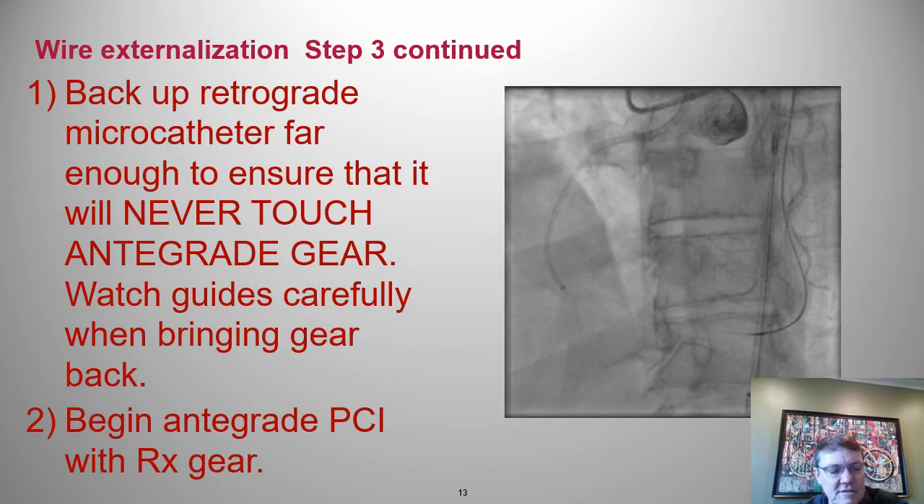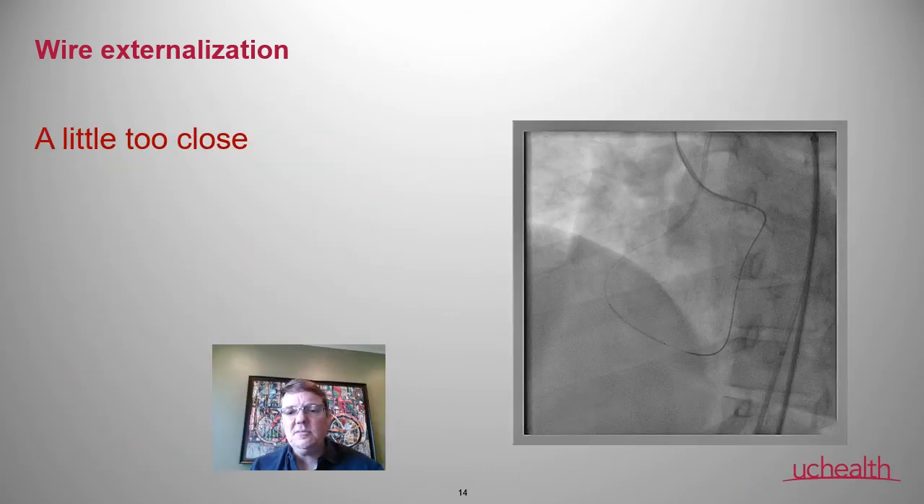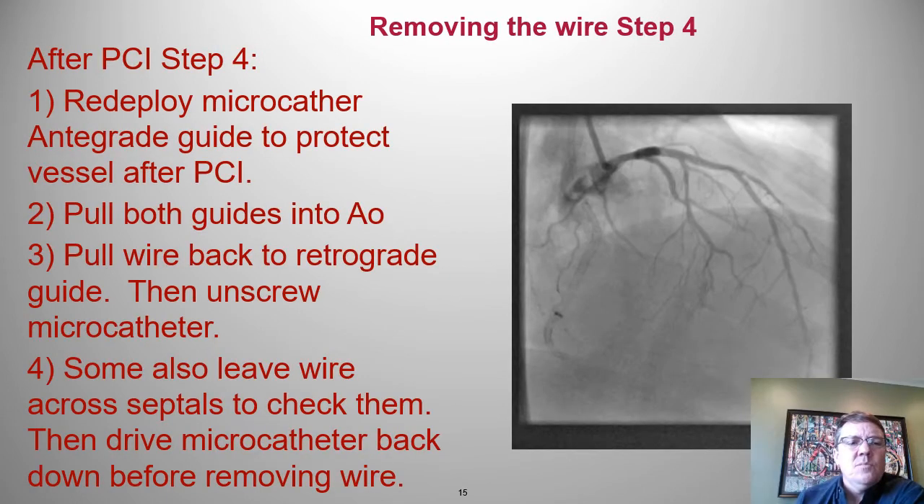We're in step three — the wire is externalized. Now it's time to bring the micro catheter back just as far as you need to do the PCI, but not too far as to expose the septals. Also when bringing it back, watch that the retrograde guide doesn't dive in deeply. You can see here I'm a little close with the stent and the micro catheter, trying to back it up as far as I can without causing trouble.